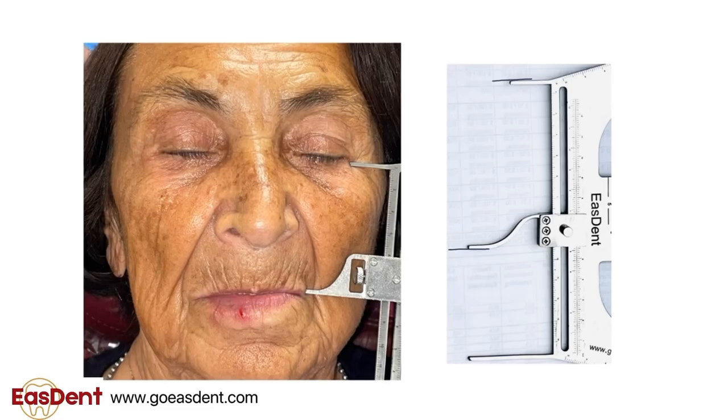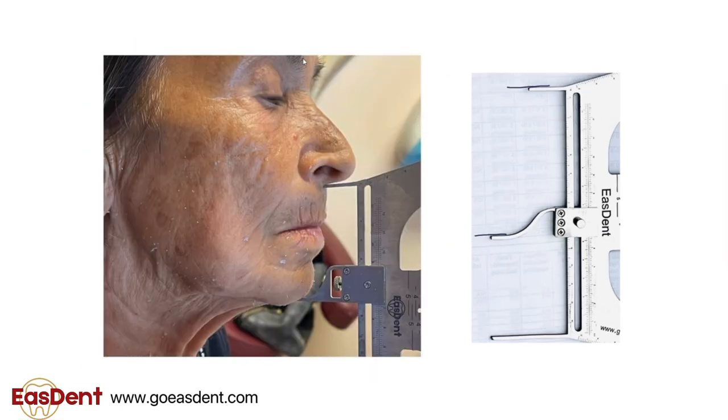Preset the VDO by measuring with the outer edge of the shorter stick matching the lateral canthus of the eye and the outer edge of the movable handle lining up with the commissure of the mouth. When you use the moldable material in the Easdent tray later to record the VDO, guide the patient to bite down slowly at the centric relation until the outer edge of the shorter stick touches the lower border of the septum of the nose and the inner edge of the movable stick touches the lower border of the chin.